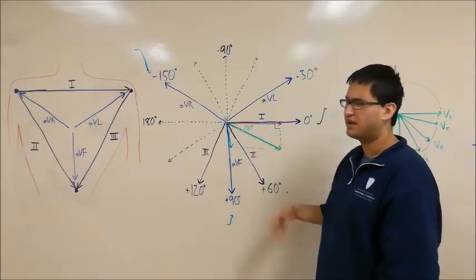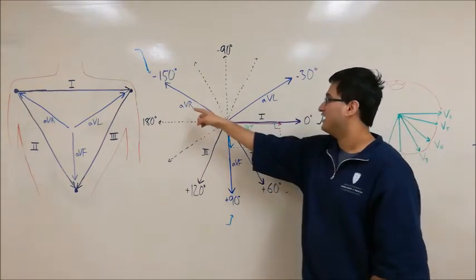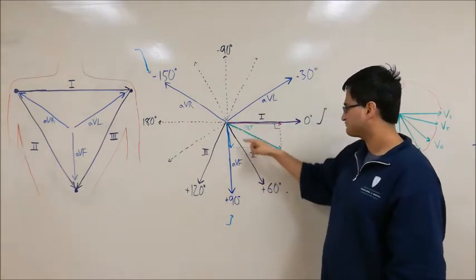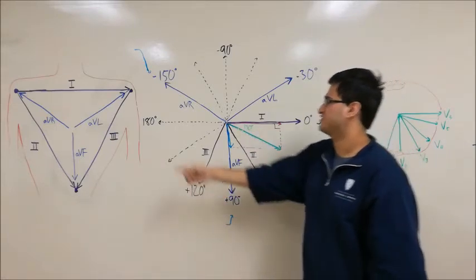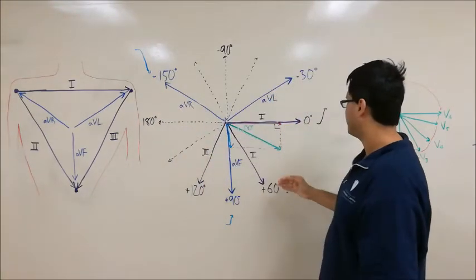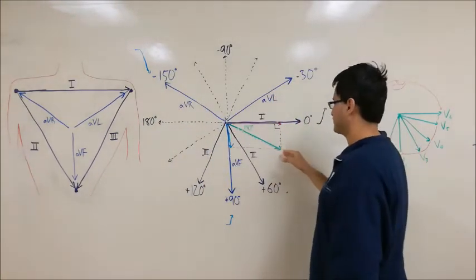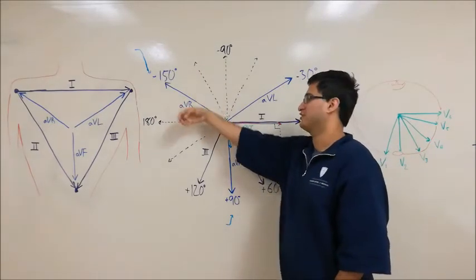Now finally, let's look at what AVR would record. Because AVR is in the complete opposite direction of this vector we have here, it's going to record it as a very, very negative deflection as we see here. Now this is more negative in magnitude than either of these, because this is completely opposite in the direction. So this is basically the full length, but completely opposite direction, so it's going to be negative.